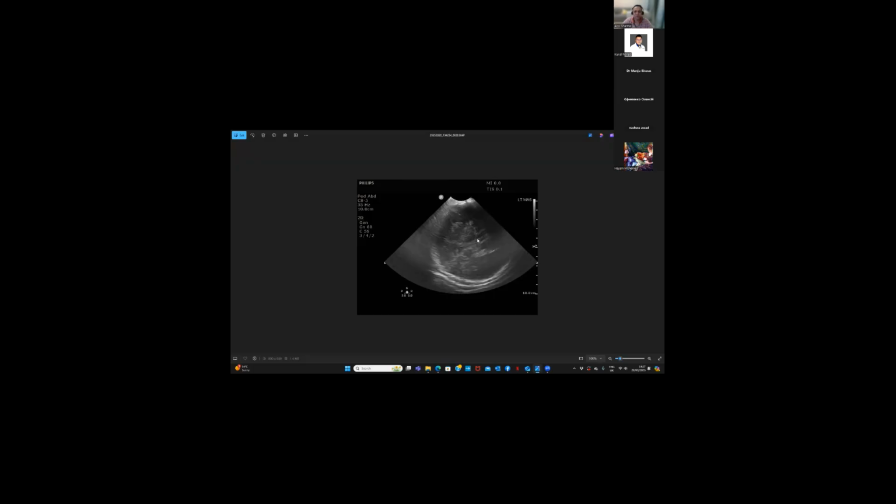So you can see what I think is probably the third ventricle, and the cerebellum is very dark at the back. This one is the cerebellum. You can see a little bit of the mesencephalon as well in the front. But well done. It's a good try. I'm really pleased. This is another one for the left side. Then I tried both parallel and perpendicular for the mastoid. So you can see the third ventricle there. Yes, this one, yeah.